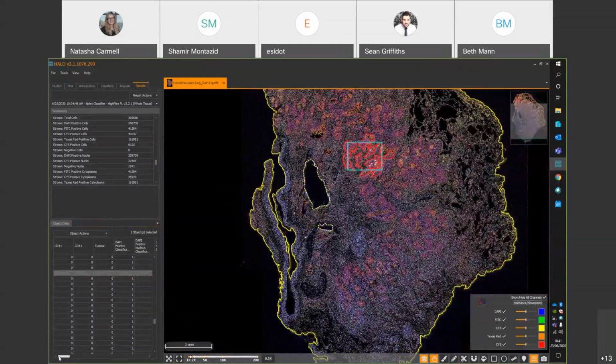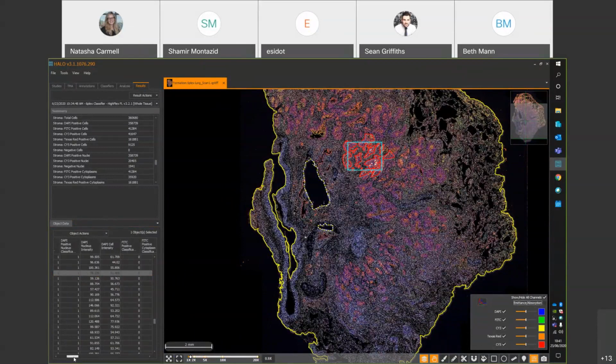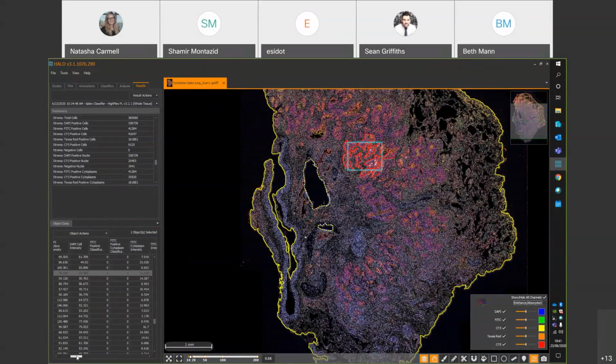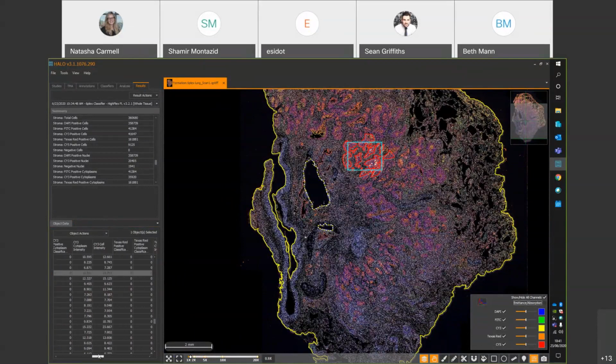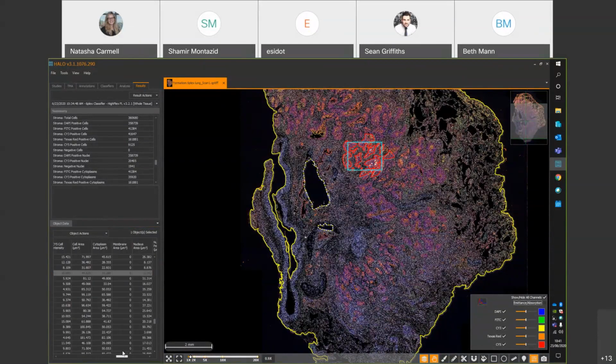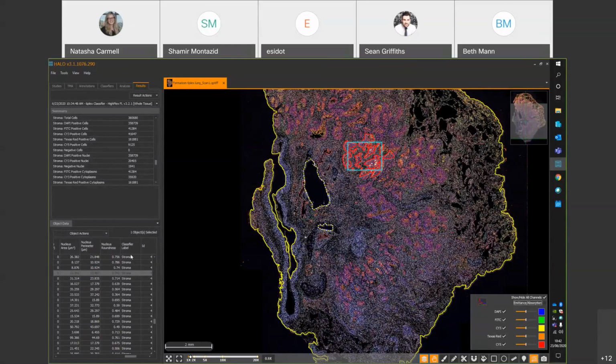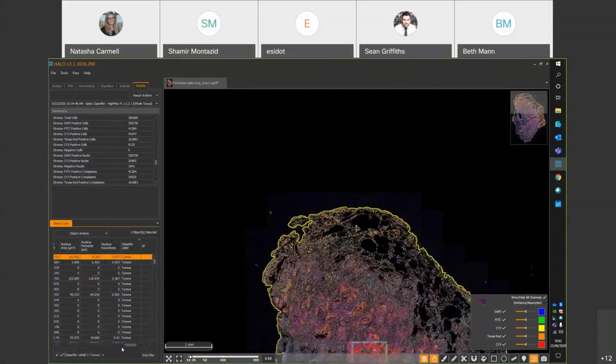So this is all of our cell data here. We've got all of our readouts for every individual cell: the intensity values within the various compartments and for the various stains for each of these, and again, just restricted to the compartments that we're interested in. You have the cell area, the same cell statistics here. And then you've also got a classifier label here. The options will be stroma or tumour for our different class types. So you can also filter this data based on whether the cell's in the tumour or stroma compartment as well.